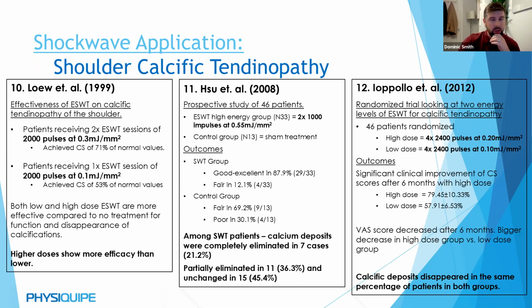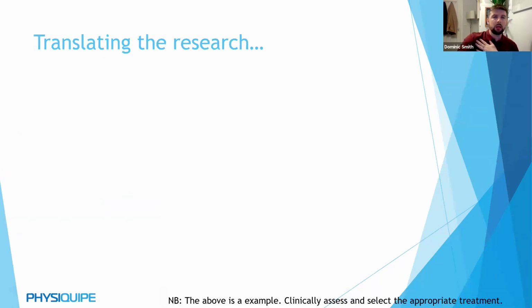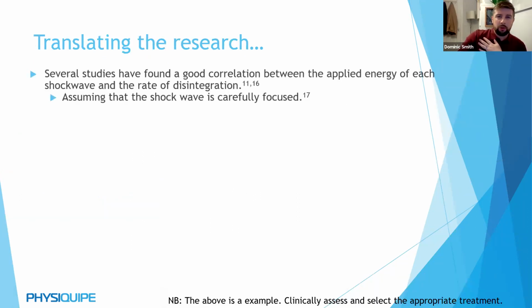So quite interesting, but the main areas that I'm more interested in here, without delving into too much information, is the actual intervention and the conclusions that they've made of how we can translate that into our practice. So if I'm looking at all of the different research papers that I've read, several studies have found very, very good correlation between the applied energy of each shockwave in comparison to disintegration, assuming that the shockwave is carefully focused.